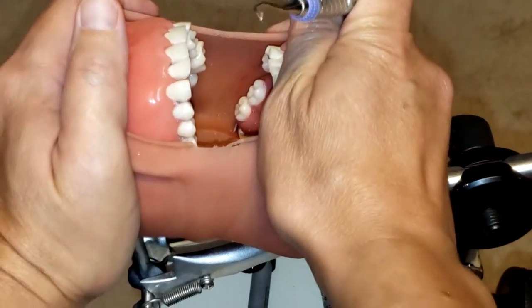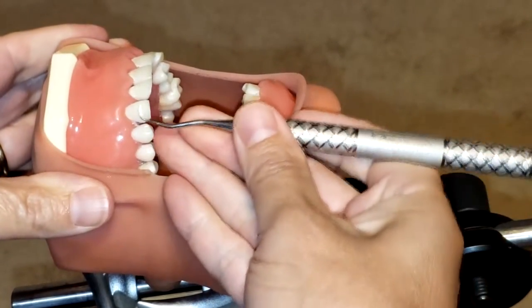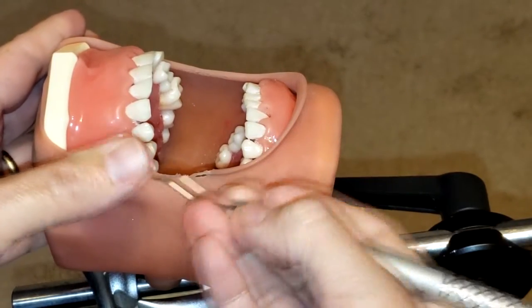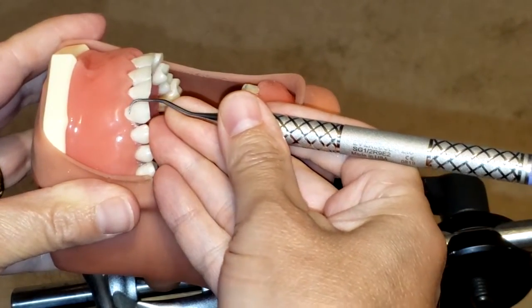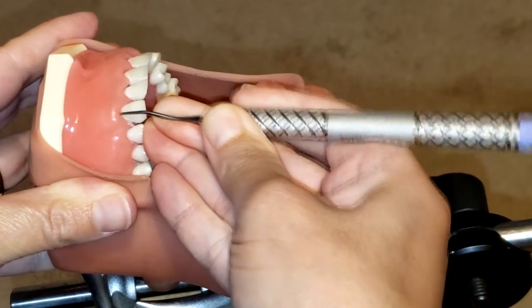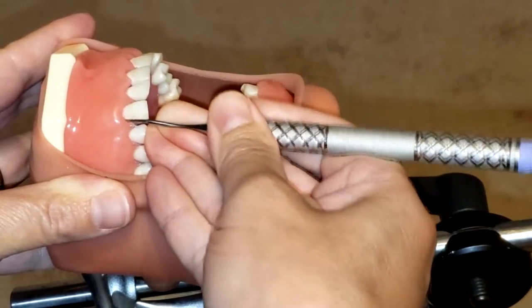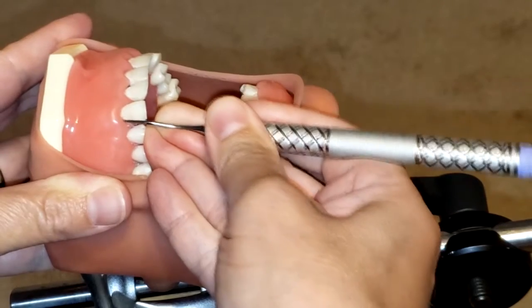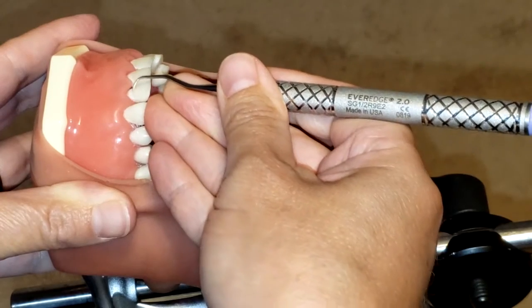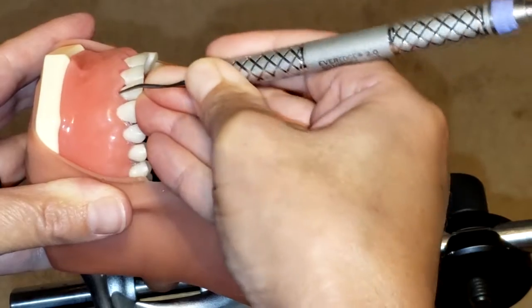Now let's get started. I'm going to begin by doing surfaces toward me, working from nine o'clock. I'll go in at the midline, insert subgingivally, making sure I'm maintaining the lower shank as parallel as possible to the long axis of the tooth, and rolling as I'm going into the interproximal space. It is important to maintain a 70 to 80-degree angulation when scaling.